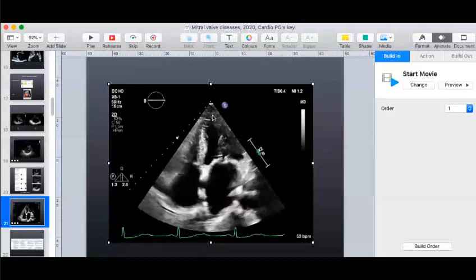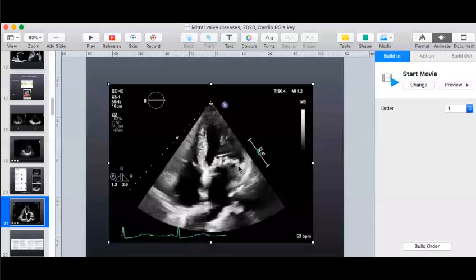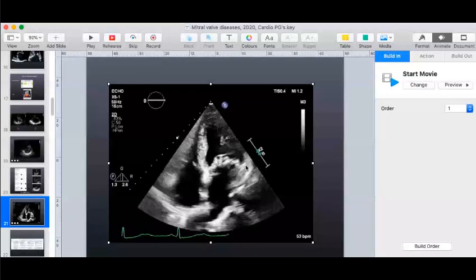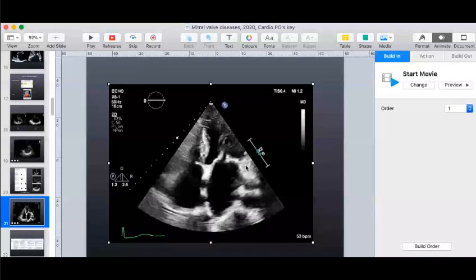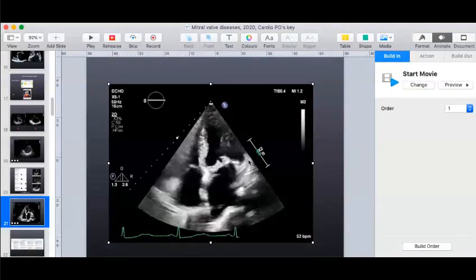But we have the four chamber view here. So this is the posterior mitral leaflet. What you do is focus on this area here. The left atrial appendage generally is a little more difficult to see in the four chamber view. This is the point where the left atrial appendage is seen, and as you said, below that would be the left superior pulmonary vein. The best view for the left atrial appendage is always going to be the short axis. Next would be the two chamber view, and third is this, where it is a little more difficult compared to the other views. So this is the left atrial appendage.